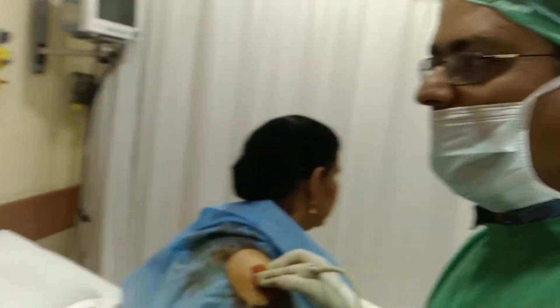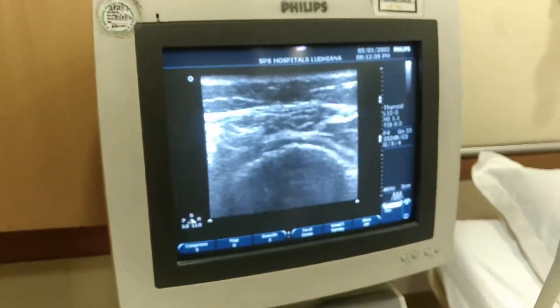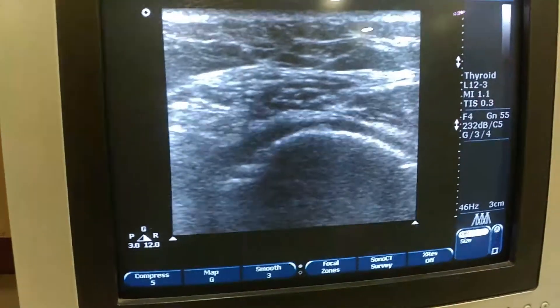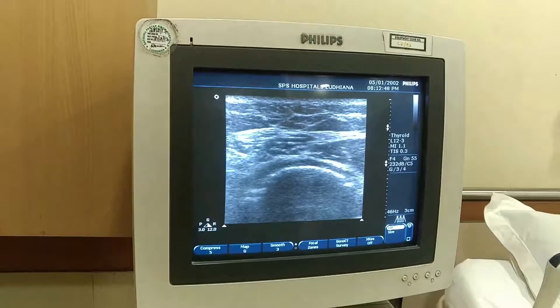Good morning Navi. I have a case of frozen shoulder here. That's the rotator cuff. See some irregularity of the bone and some specks within the rotator cuff.